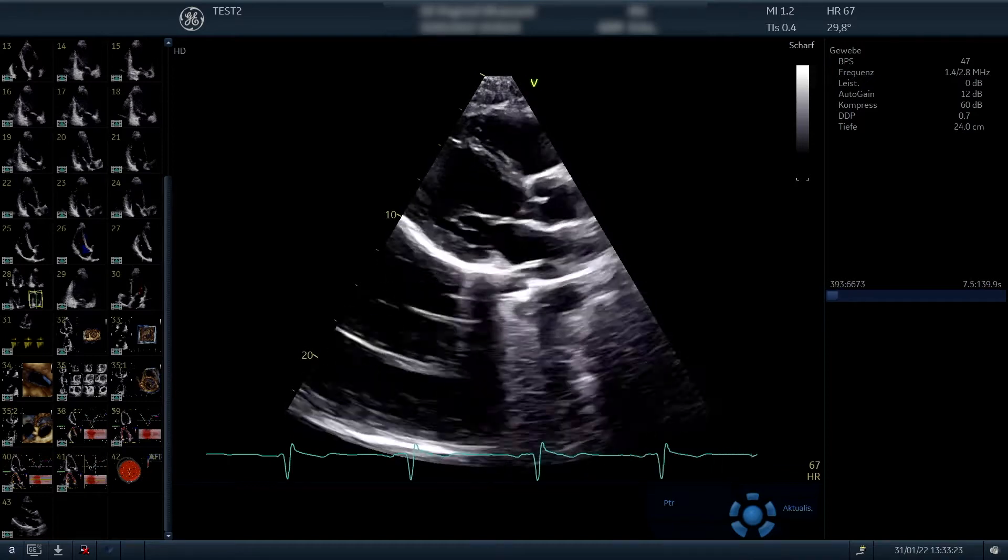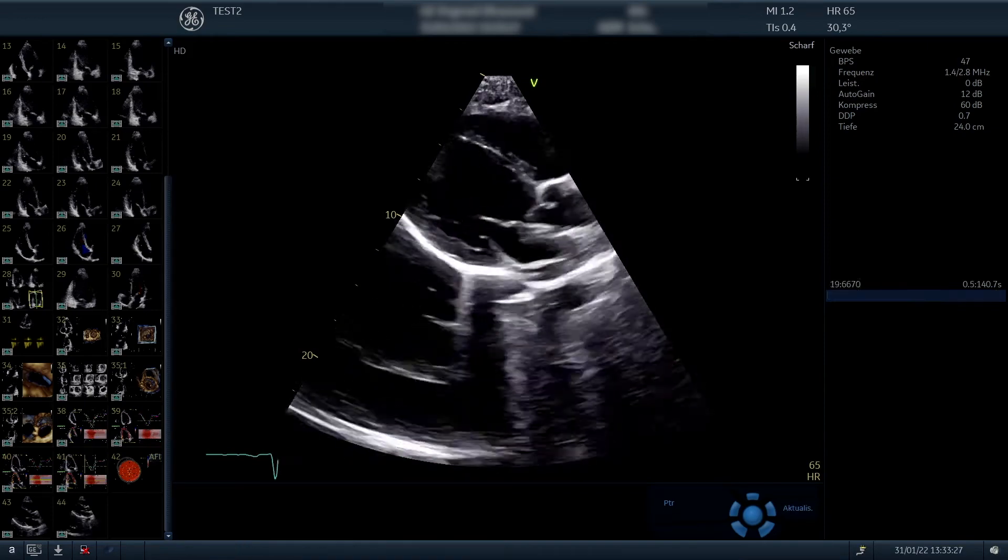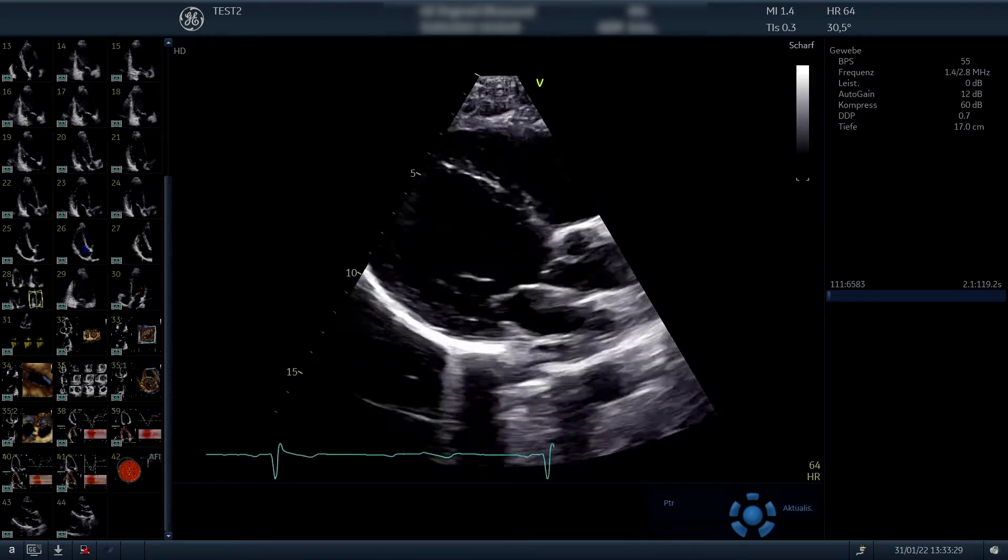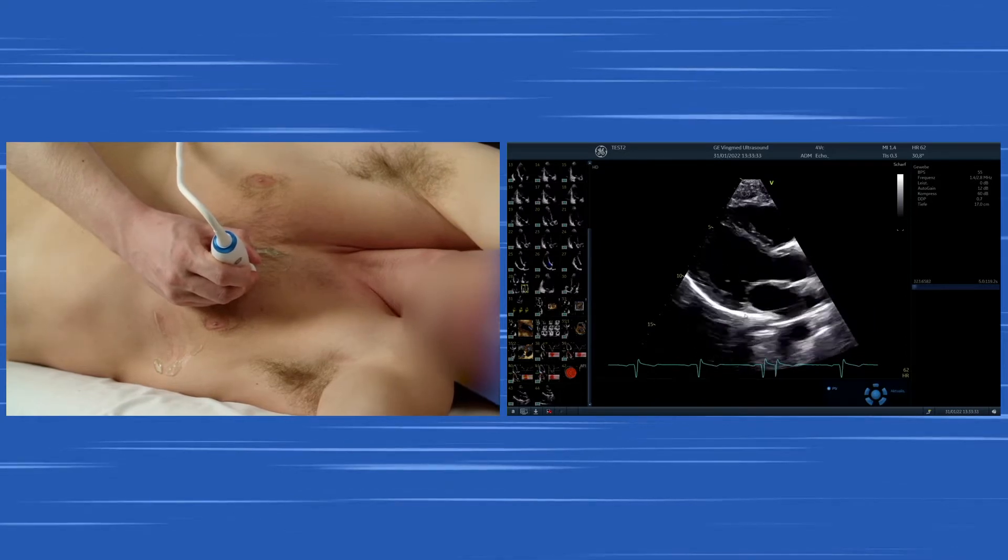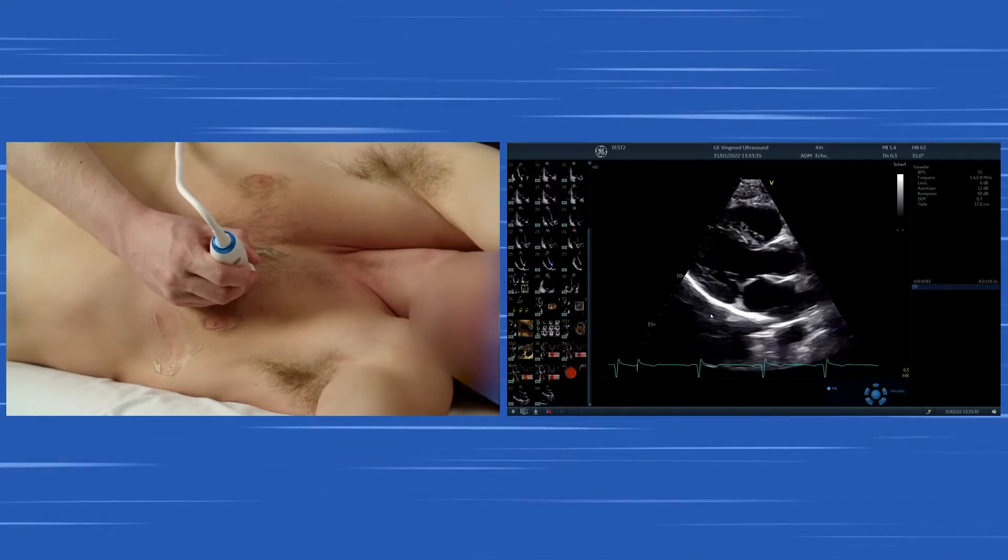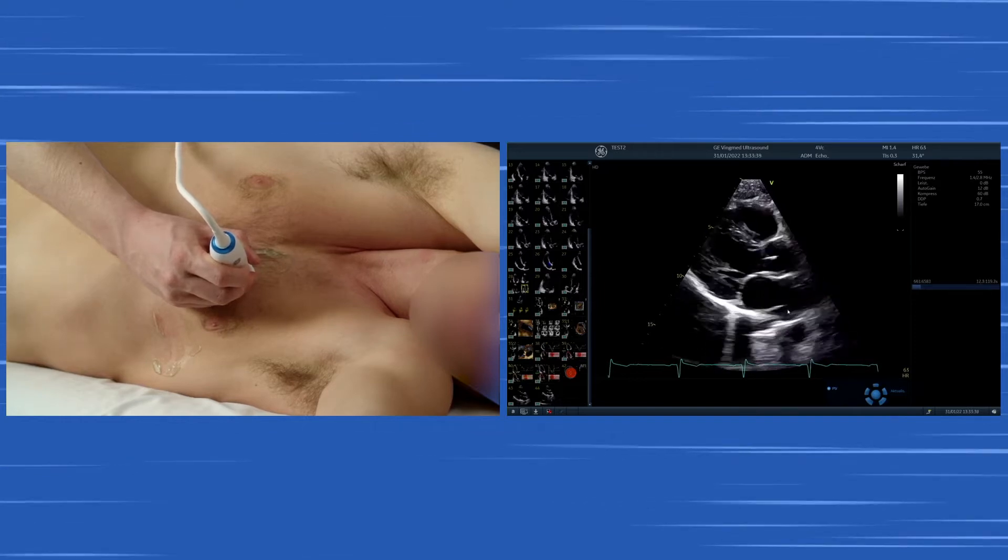We see the parasternal long axis view and below we have a little bit of space where we can differentiate pericardial effusion. Then we go a little bit more towards the anatomical structures. That was just the descending aorta, that's the pericardium, and in this area we would see pericardial effusion or below pleural effusion.